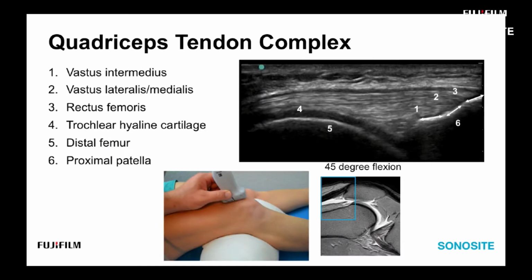First, as you can see in the photograph, we're just going to start at the patella, and then we're primarily just focusing on this mid-sagittal shot to assess the quadriceps tendons complex. And we're really looking at the enthesis here, right along the patella. There's three distinct, almost flat facets on the superior part of the patella.